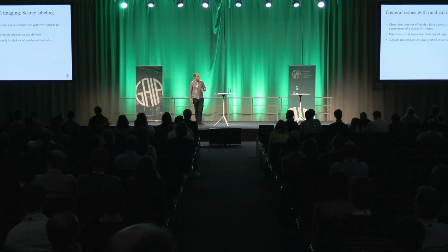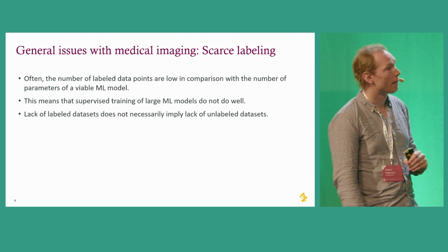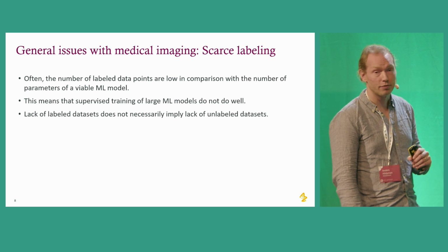Then we often have the problem of scarce labeling as well. We need a medical professional to label these, as you saw before in this image, where we did the segmentation, and also for views.